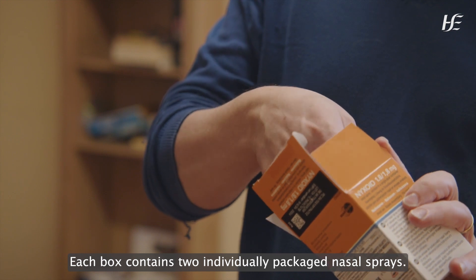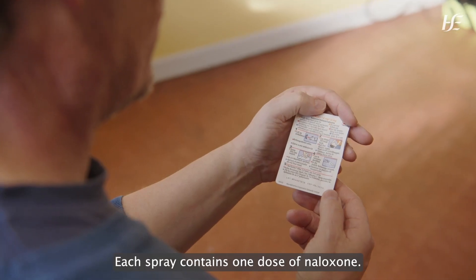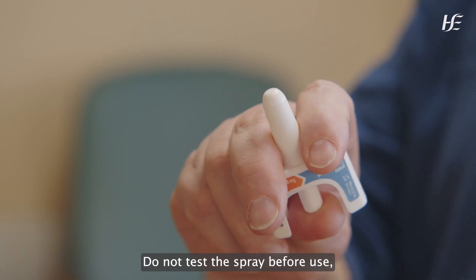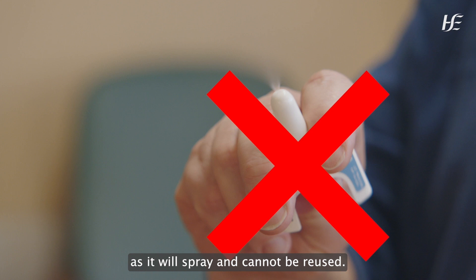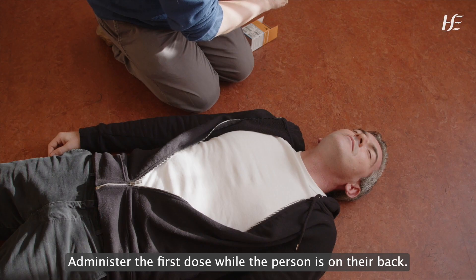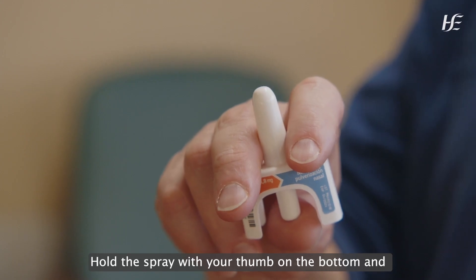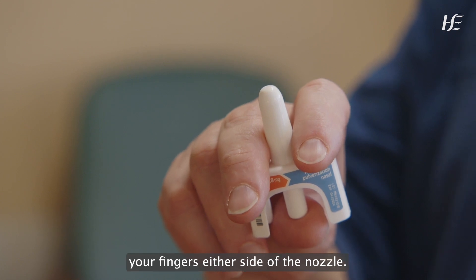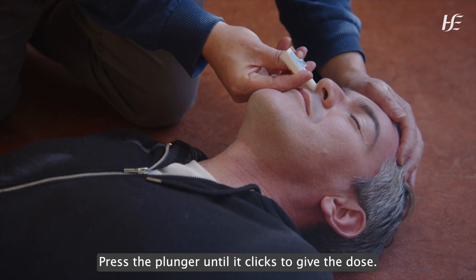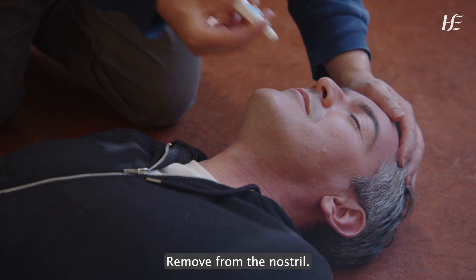Each box contains two individually packaged nasal sprays, and each spray contains one dose of naloxone. Do not test the spray before use, as it will spray and cannot be reused. Administer the first dose while the person is on their back. Tilt their head back. Hold the spray with your thumb on the bottom and your fingers either side of the nozzle. Gently insert into the nostril. Press the plunger until it clicks to give the dose. Remove from the nostril.